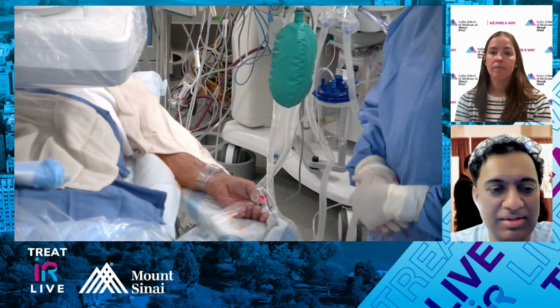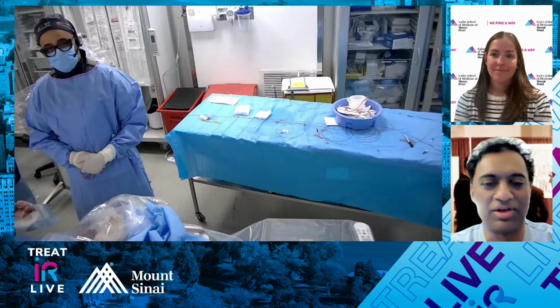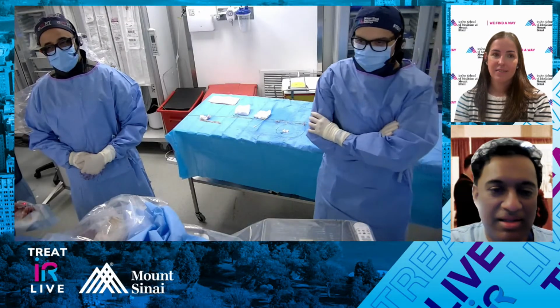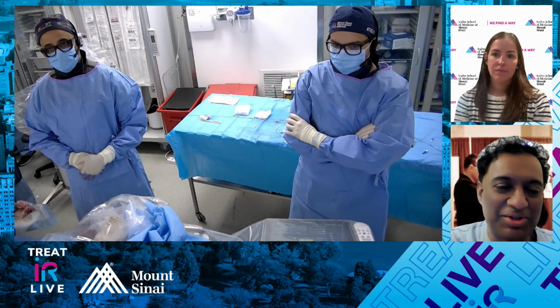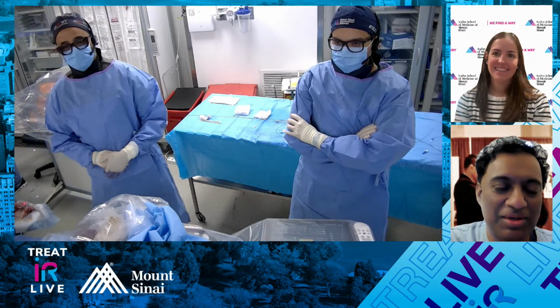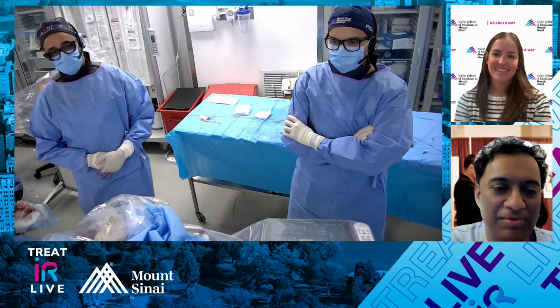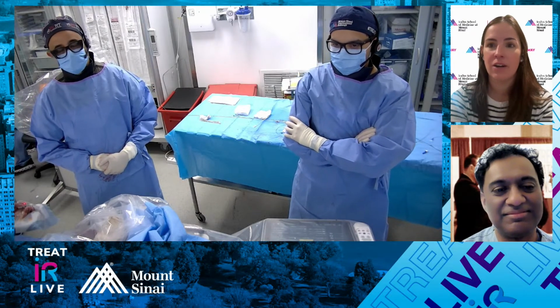This is an awesome case. I did like the combination with the large coil mass and then the intermediate coils. I guess it used to be the largest coils like microcatheter, but now you have the intermediate, the large, and the small, the LP. Nice to have. Great case. Great result, Joji. Thank you for being here with us today.